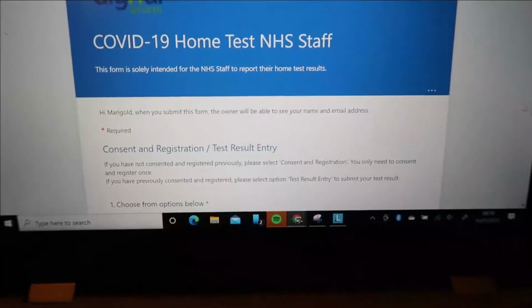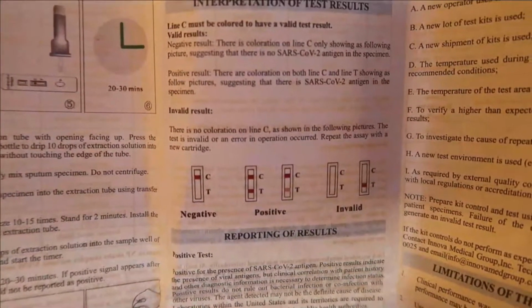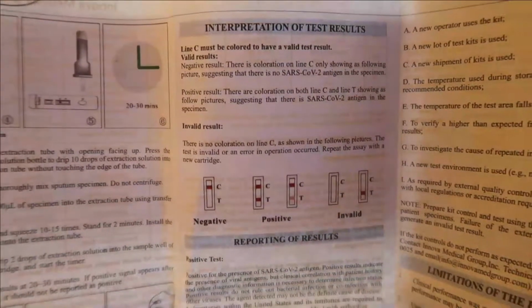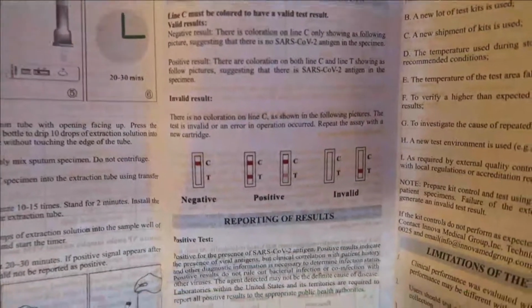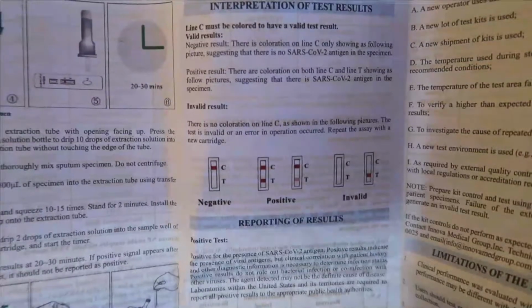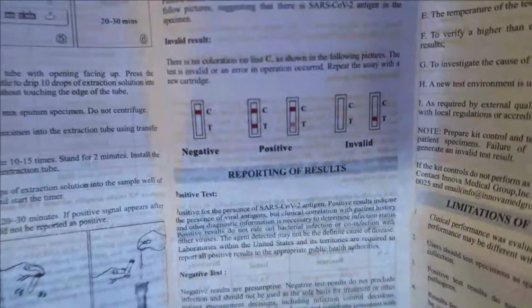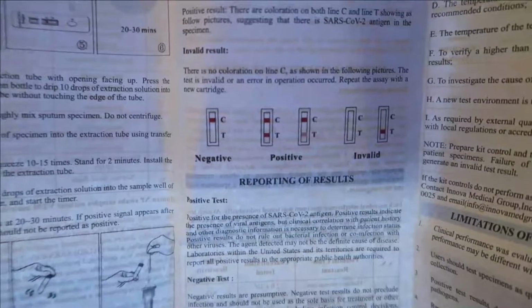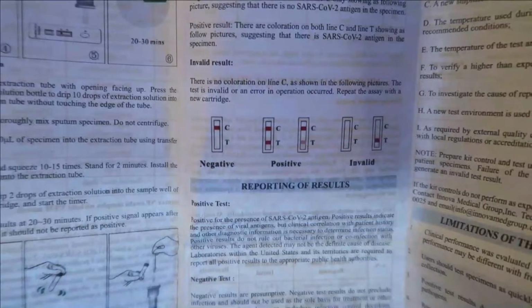And also I want to show you the result, how it's being interpreted. Here is the interpretation of results. Negative if it's only the C part, or the control part. Positive if you've got two lines there, even if the T part is a bit fading. And then there's an invalid result when the line is on the T, or there's no line at all. So you just have to redo the test if that's the case.